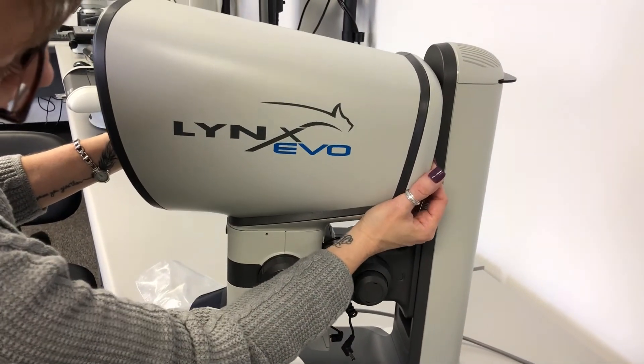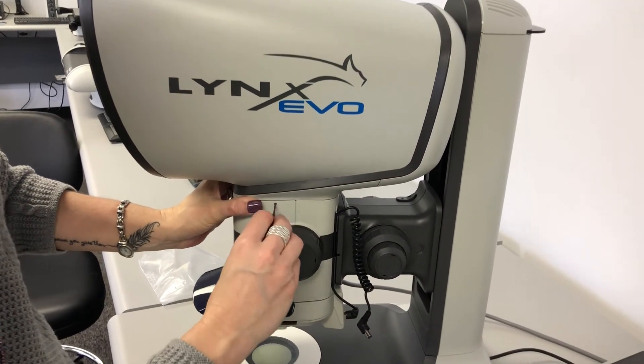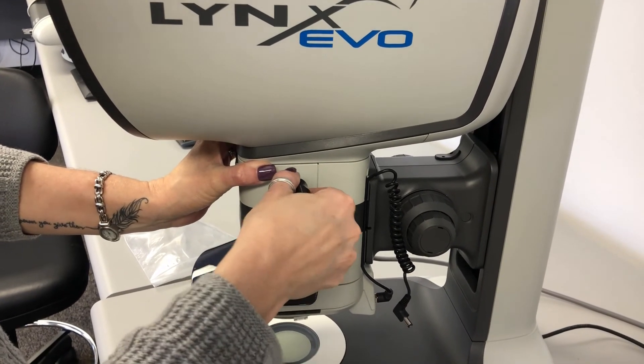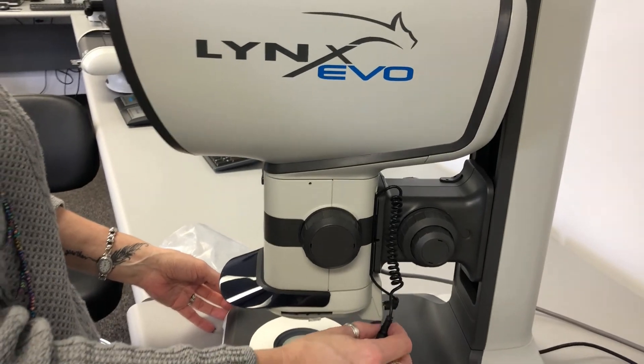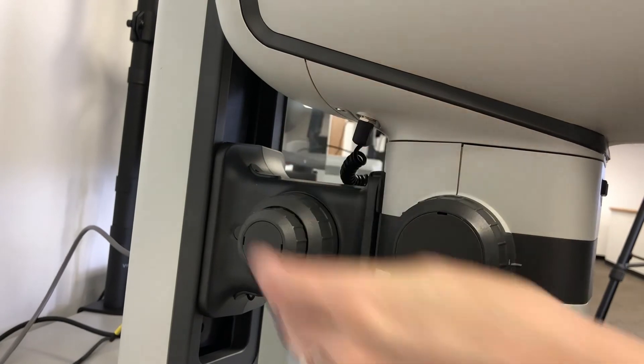Replace the head and secure using the set screw. Attach the power cable, and you're ready to go.